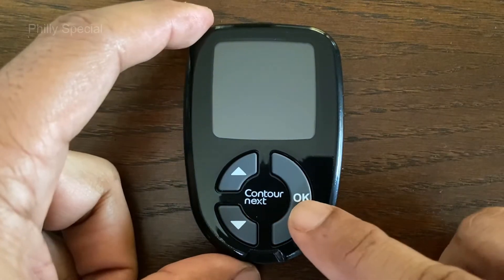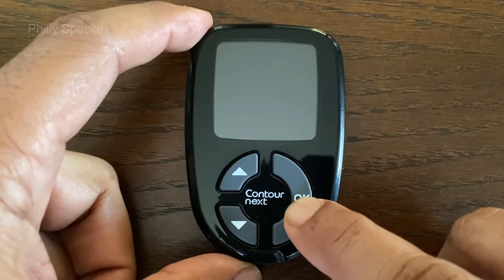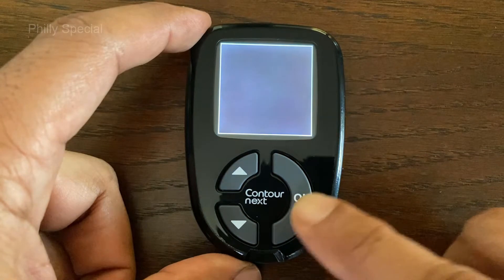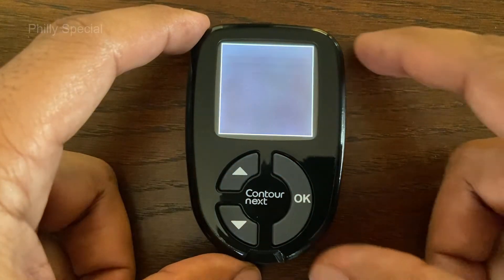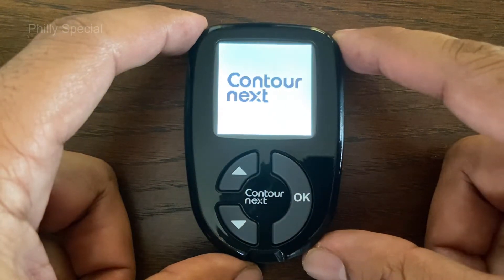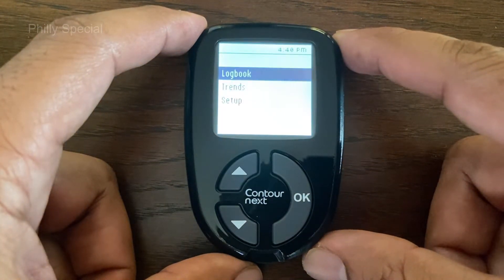This video shows the steps to change the preset date and time in the Contour Next Blood Glucose Meter. Press and hold the OK button until the meter turns on.